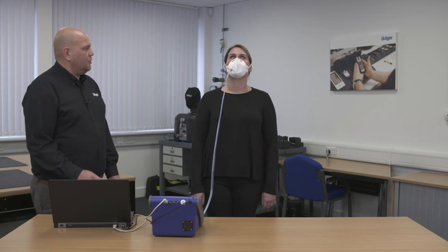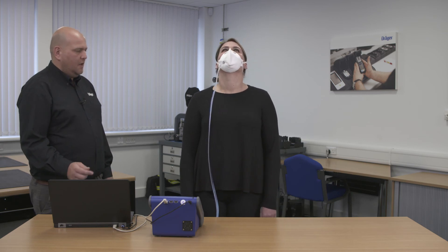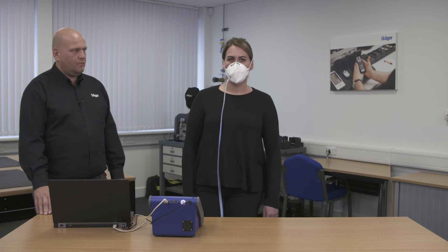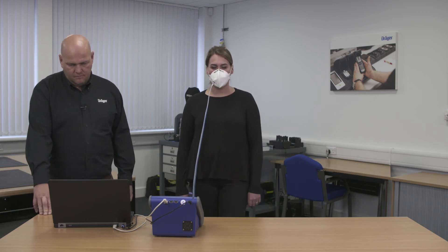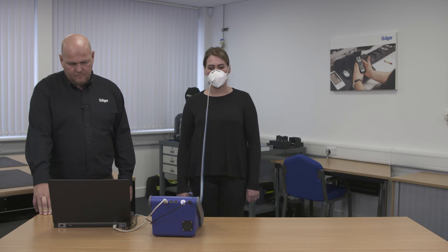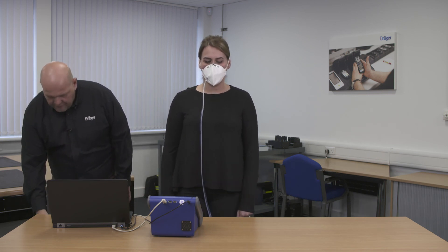On the beep of the machine, I want you to slowly count down from 100 towards zero as if we were having a natural conversation, but continue to step slowly backwards and forwards. On the next beep, stand still and lean forward so the mask points down towards the floor, then back to a standing position.